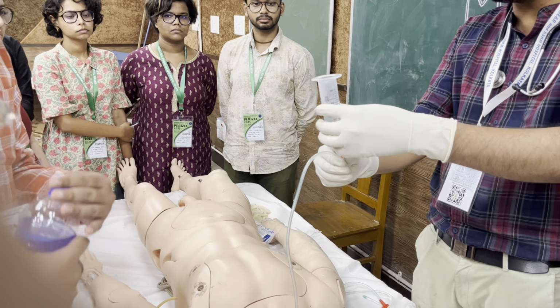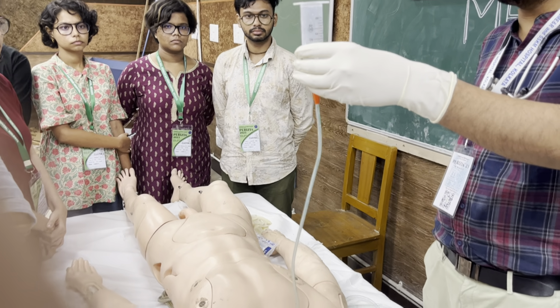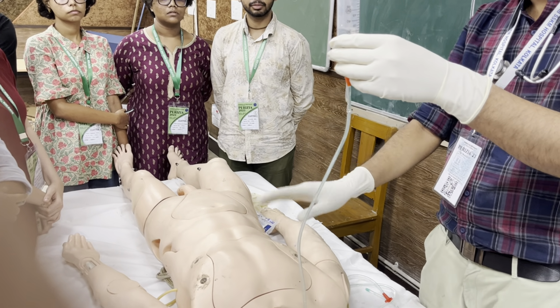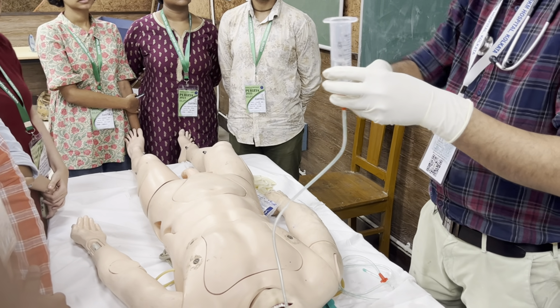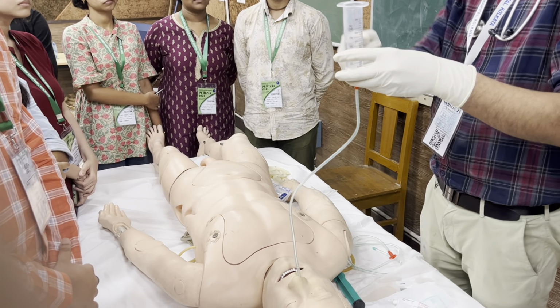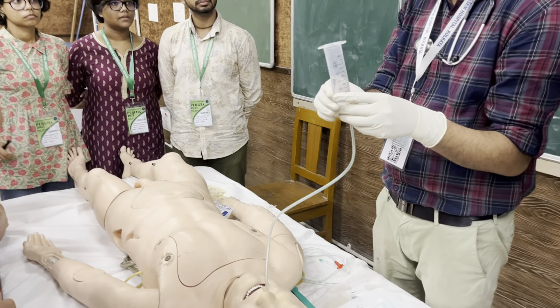Now after giving the food, I'll keep it like this. Okay, ideally in a real scenario it will go spontaneously. No need of a plunger, because if you try to push it, it will go into the wrong track because of the pressure effect. There may be injury. So ideally it will go. That is, it is a mannequin. It may not be properly visible.